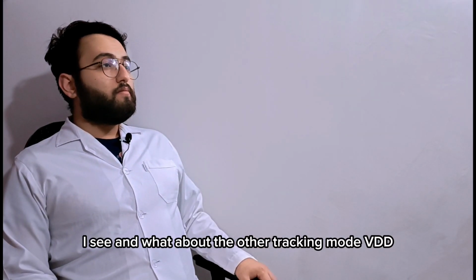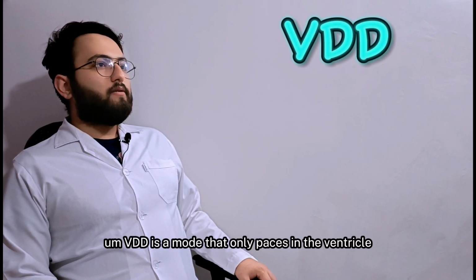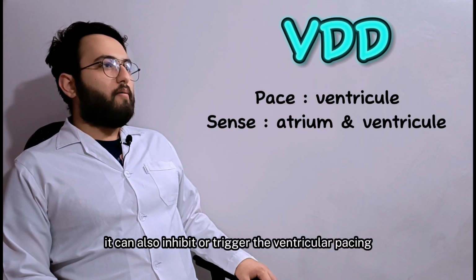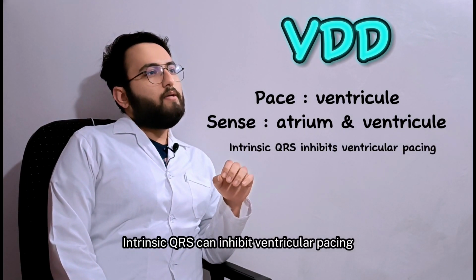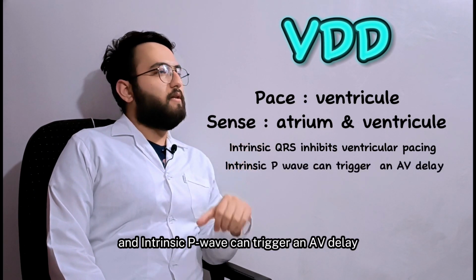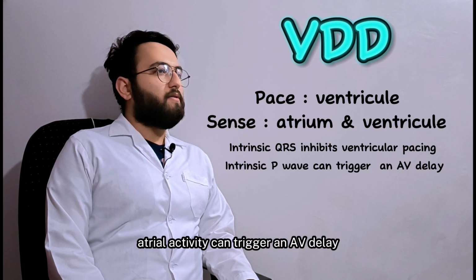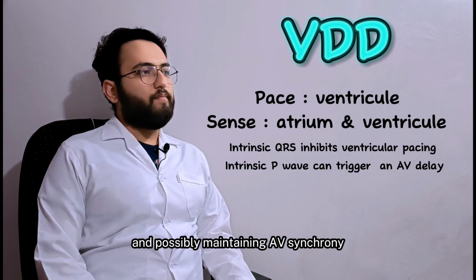I see. And what about the other tracking mode, VDD? VDD is a mode that only paces in the ventricle, but senses in both the atrium and ventricle. It can also inhibit or trigger the ventricular pacing based on the sensed signals. Intrinsic QRS can inhibit ventricular pacing, and intrinsic P-wave can trigger an AV delay. In this mode, one cannot pace the atrium, but an intrinsic atrial activity can trigger an AV delay, resulting in P-wave tracking and possibly maintaining AV synchrony.